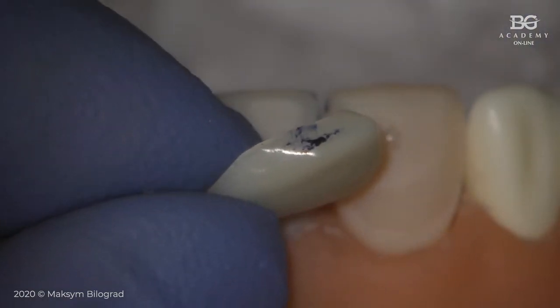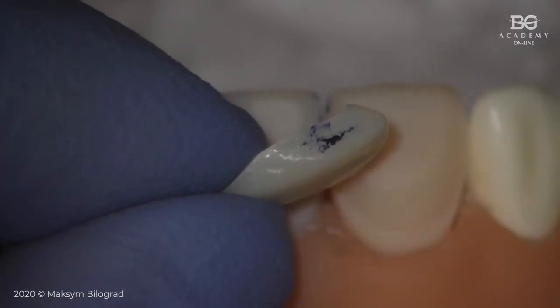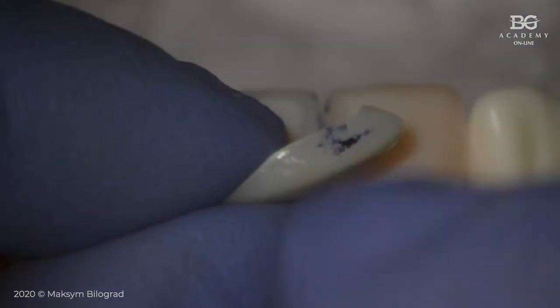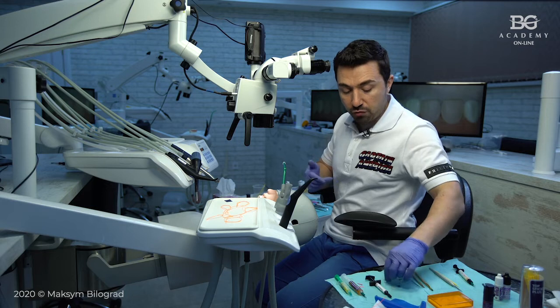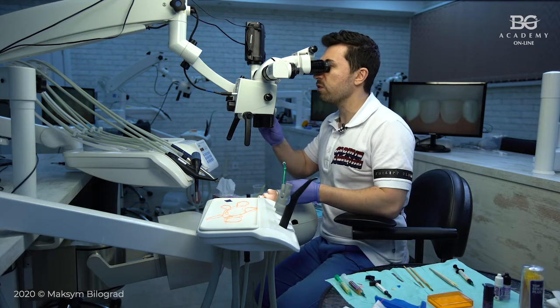I will skip the adjustments. You will make some adjustments of these tight interproximal contacts with these rubbers. Then you have to polish them, the same as your dental technician does, with several rubbers to make a really lustrous polish. And then you can go to preparing the ceramic surface for adhesive cementation.